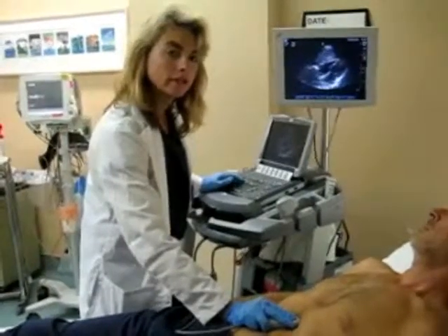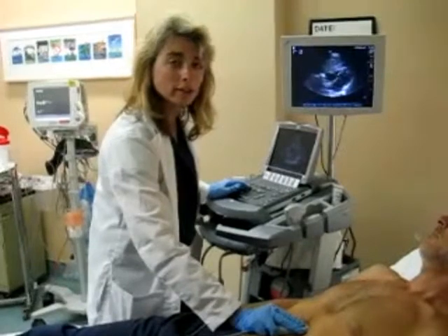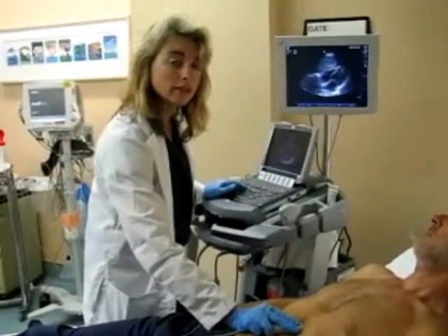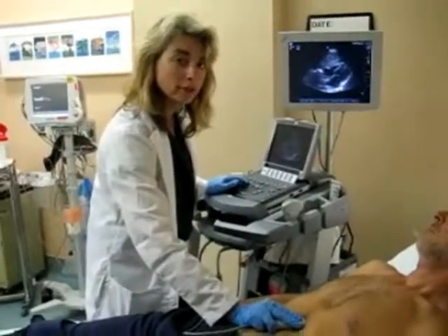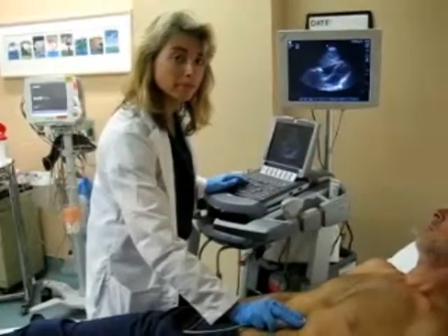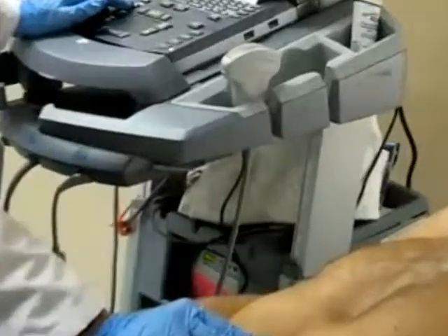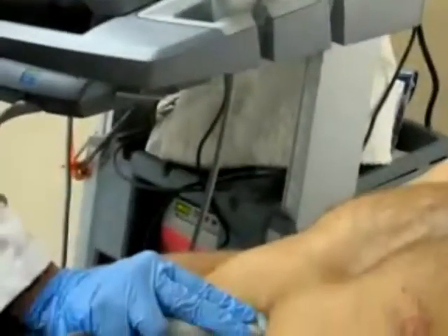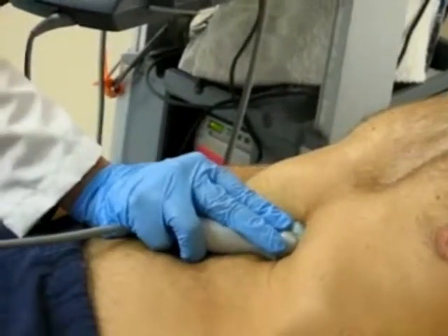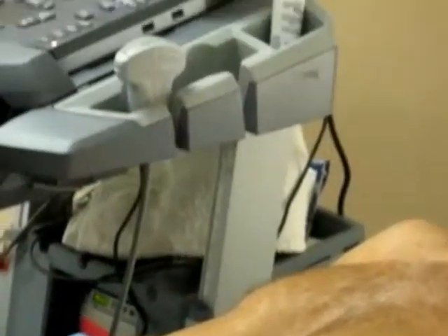The next view in the FAST evaluation is a view of the heart to assess for pericardial fluid, which in the setting of penetrating trauma can be indicative of impending tamponade. The probe is held below the sternum, aiming upwards and slightly to the left, which gives this image on the screen.